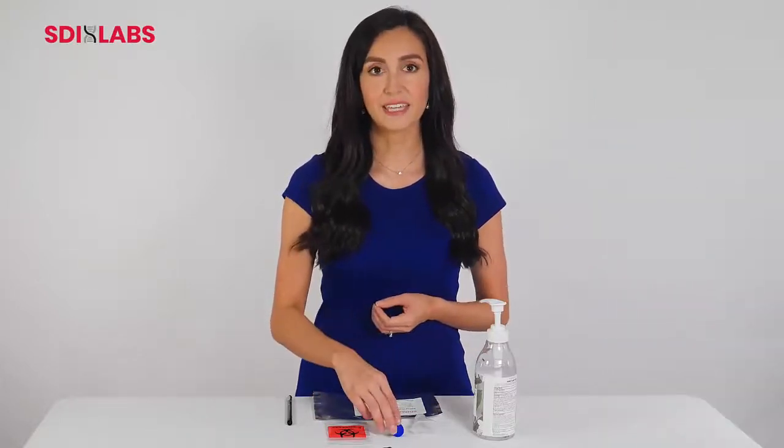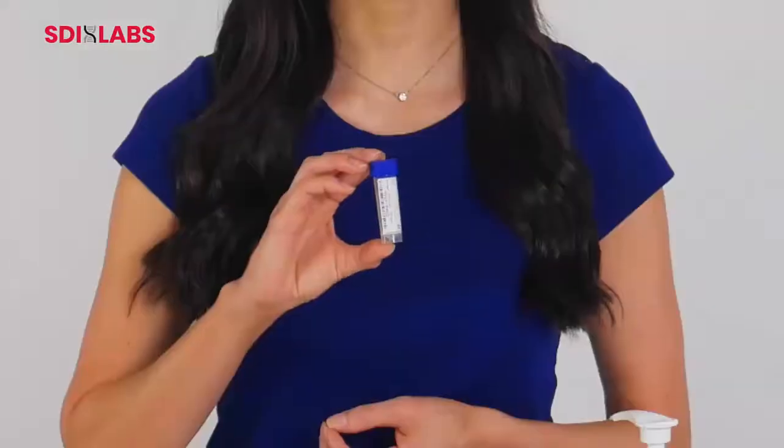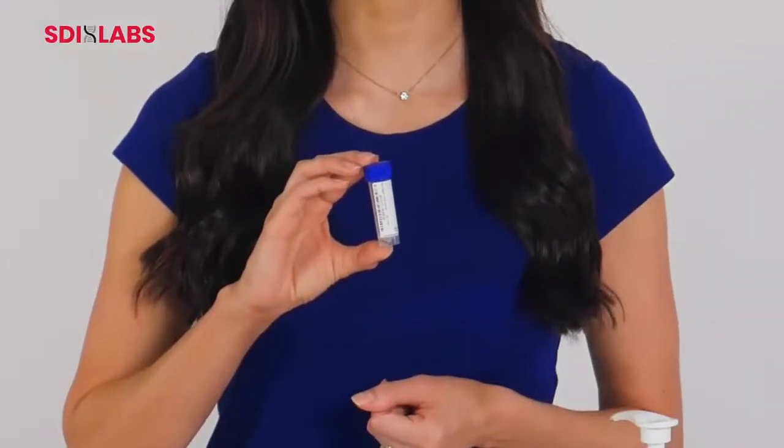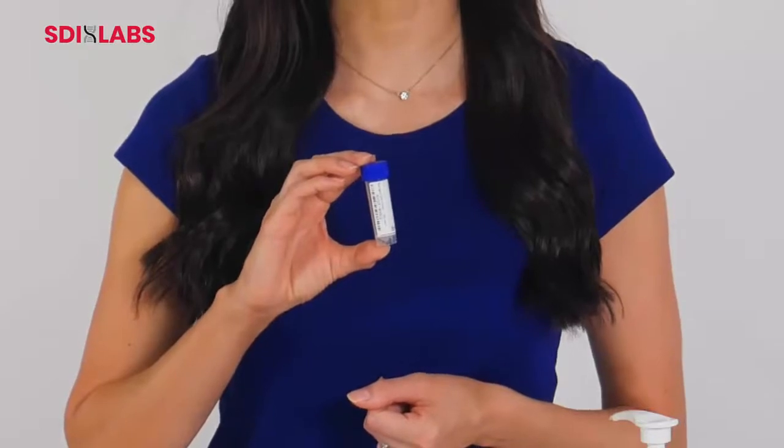The SDI saliva kit tube comes with one tube. Though this tube might look empty, it is lined with a dry matrix that will dissolve in the saliva sample.